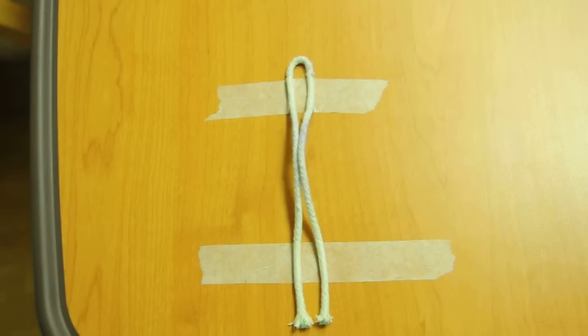So remember, if you're right-handed, you're tying right-handed two-handed ties and left-handed one-handed ties.